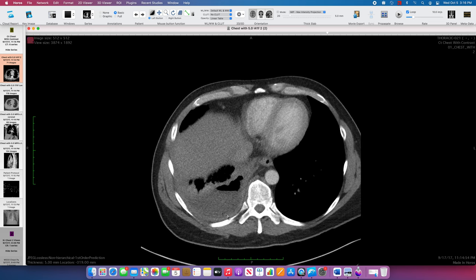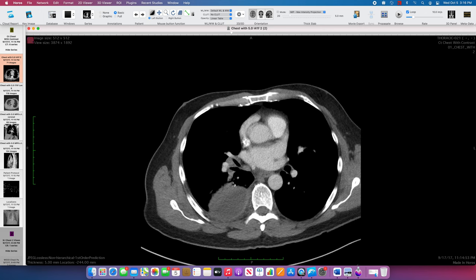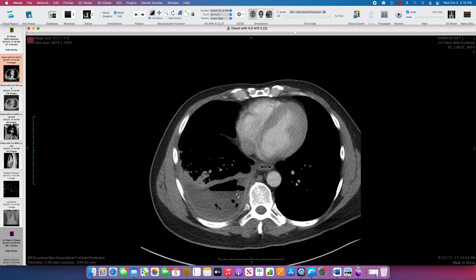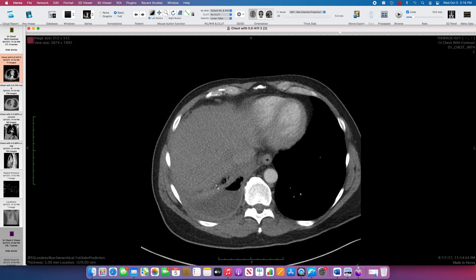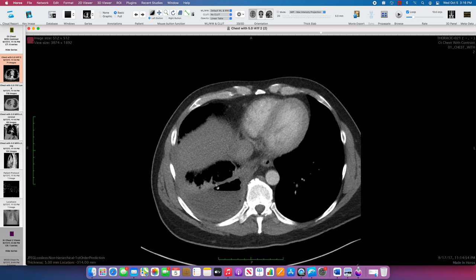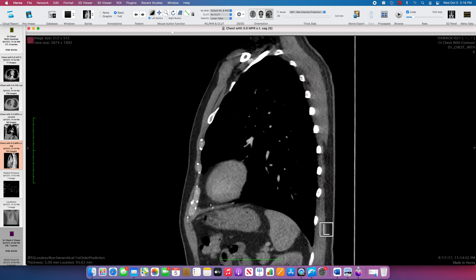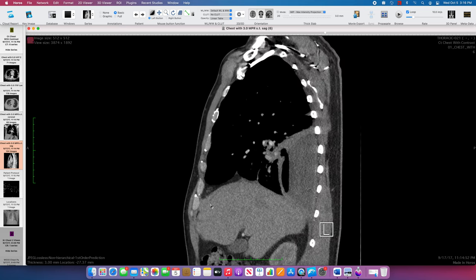You don't have any lung architecture surrounding any of this space — it's displacing the lung, not occupying the lung. And then it's got this kind of bulge appearance into the thorax. On the normal left side, compare to the other side and look at how it's bulging into it — so much so that if I created a full circle here, that epicenter would be outside of the thorax. That is one of the ways of determining this is likely outside the lung and a pleural process.